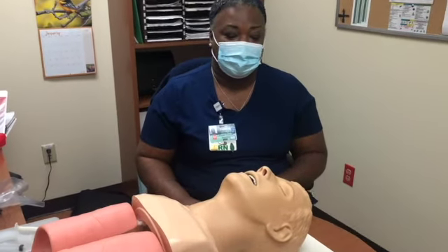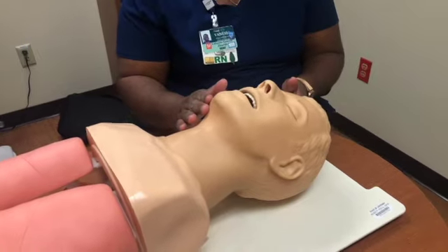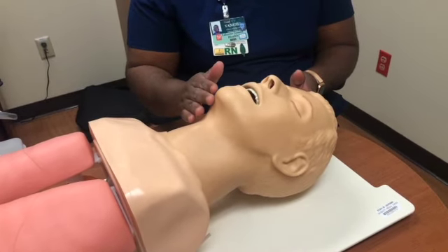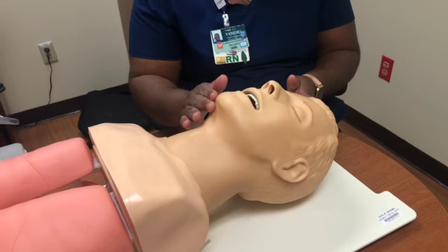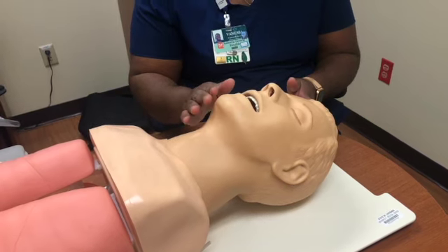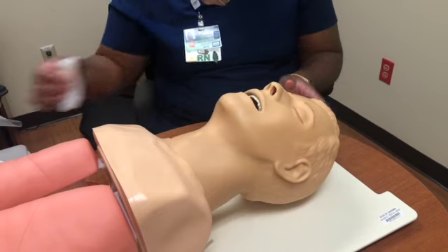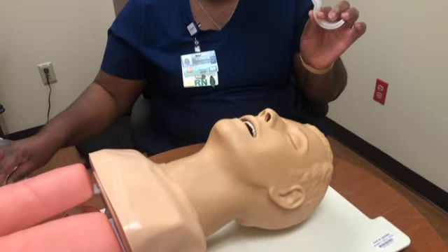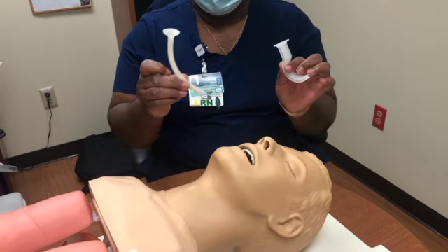When we're talking about airway management, you want to make sure that your patient is positioned correctly so they get maximum airway. Make sure their head is tilted back if need be. There are several things you can use to help the patient with their airway. One is an oral pharyngeal airway. The other is a nasal pharyngeal airway.